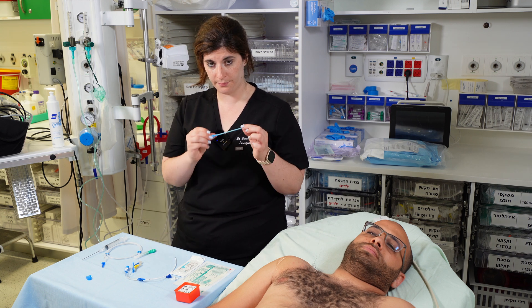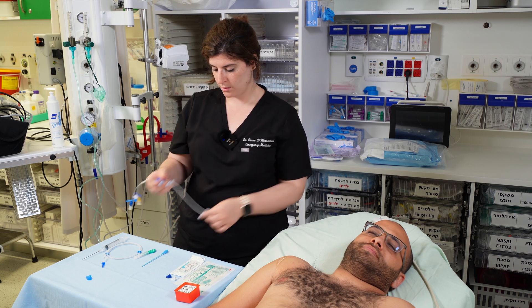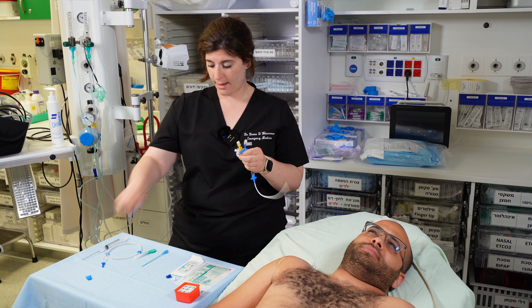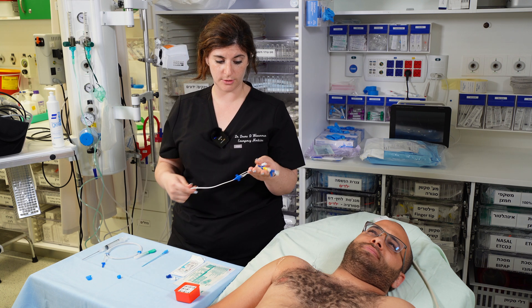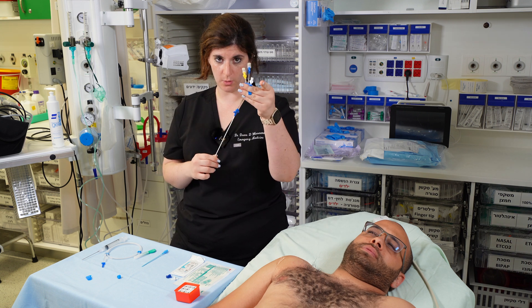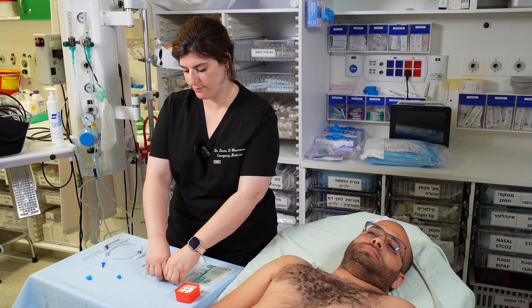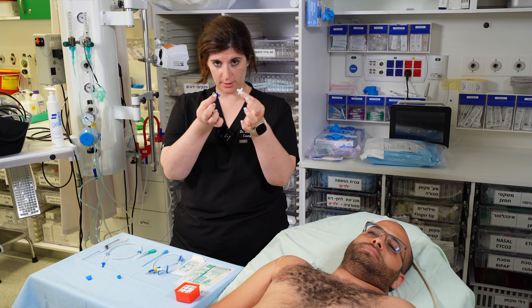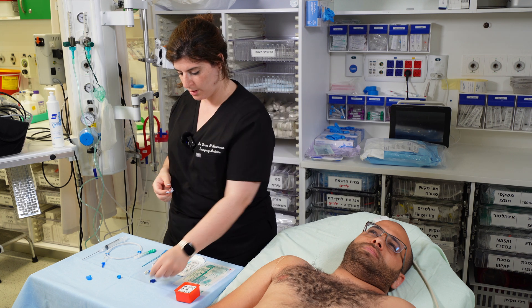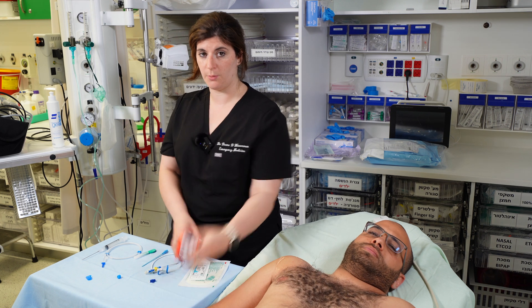Next to the wire, place your scalpel, then your dilator, then the triple lumen central line. Remove the white cap from the line — it's not always white, but it's always the shortest one — because that's where your wire will exit. You'll also have a holder for the line, a suture, a dressing, and a sharps container.